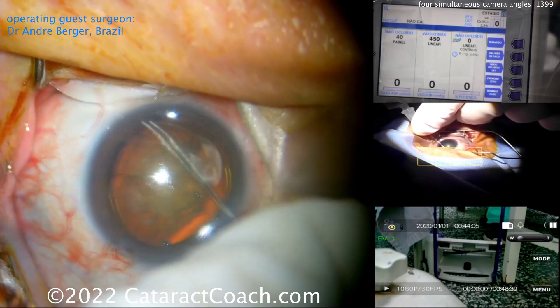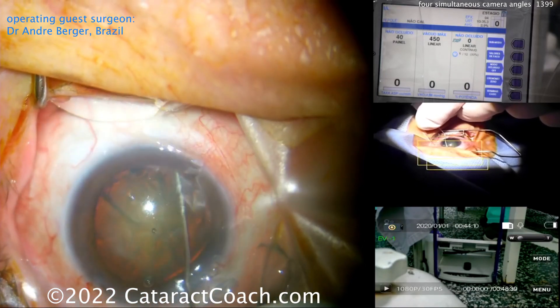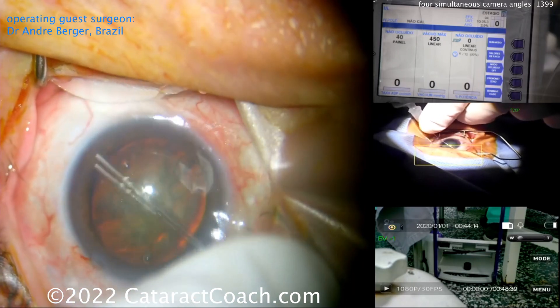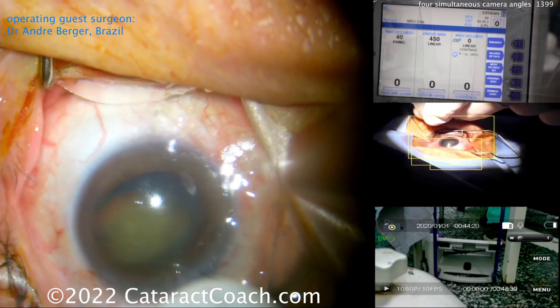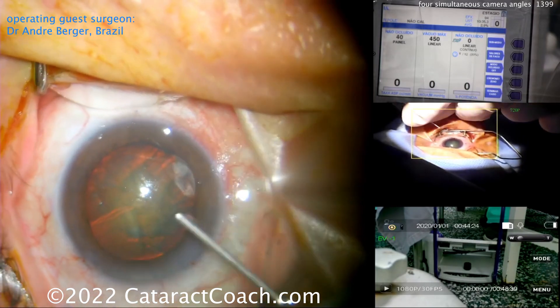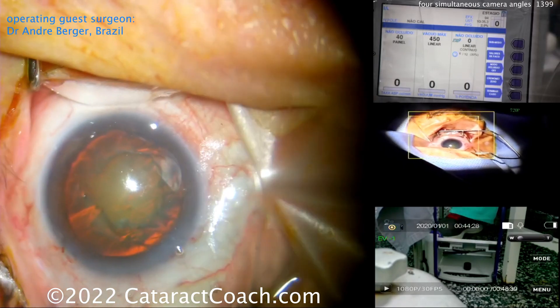Now look at his BSS cannula — look how important that is. He does what I do, and a lot of surgeons do this: hold the hub of the needle or cannula. You don't want it to shoot off inside the eye, so you always have that hub being held. Look at that inset photo on the right — that's key. Very subtle but very important. More viscoelastic going in again, holding the hub.